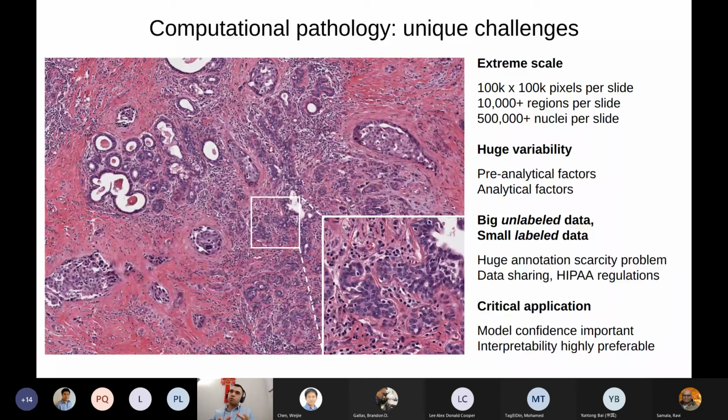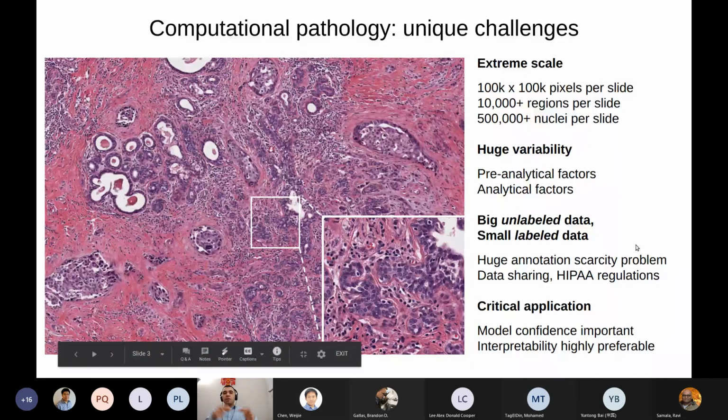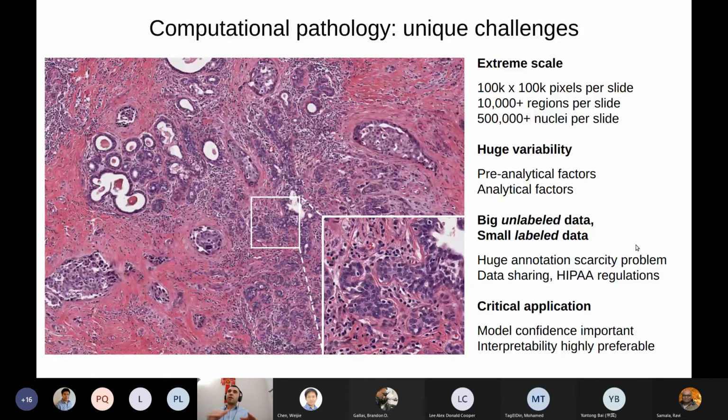Computational pathology is the field where we try to really quantify all of these things in a reproducible and very scalable way, sometimes in a way that is not even possible using manual methods. So computational pathology really starts with the technology of whole slide scanning. What you're seeing here is just a small part of a whole slide image. Basically, you take these slides, put them under a scanner, and scan them at an extremely high resolution, usually gigapixels in size, and actually gigabytes in actual disk space.